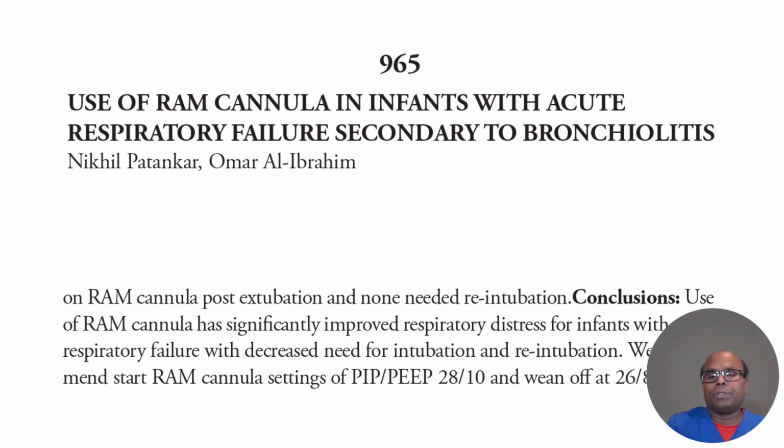I want to show you this paper presented at one of the conferences: usage of RAM cannula in infants with acute respiratory failure secondary to bronchiolitis. As you can see here, it significantly improved the respiratory distress for infants with respiratory failure and decreased the need for intubation and re-intubation.